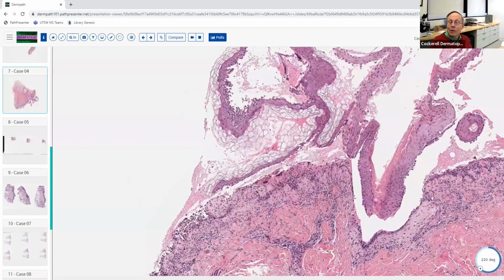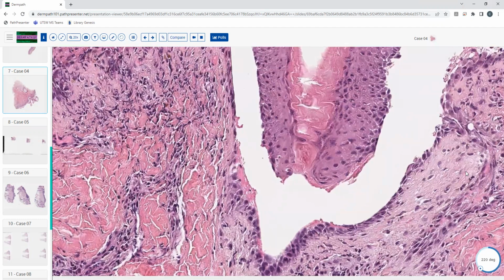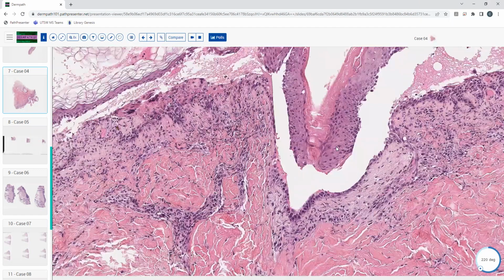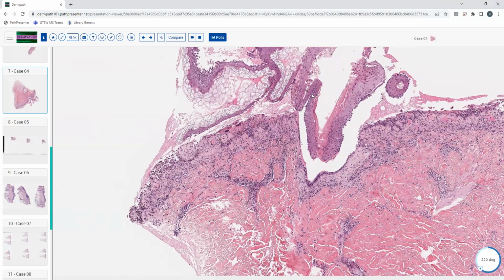And what do we have here? What's going on in this area? Well, in this split right here, you see the tombstoning, where you see the basal layer at the bottom that's still adherent. And then what do we have in this structure right here overlying that? I mean, it's just the rest of the epidermis there, but there's not a ton of acantholysis. Notice, this is a hair follicle. Oh, okay, gotcha.